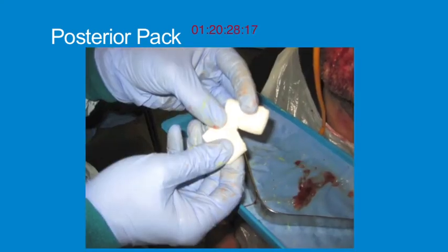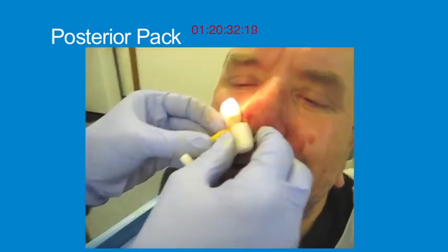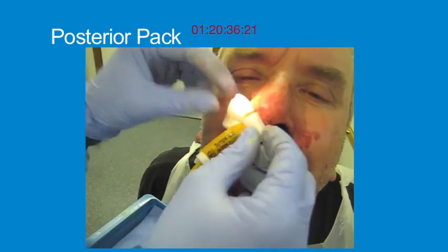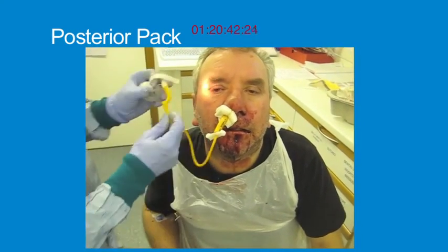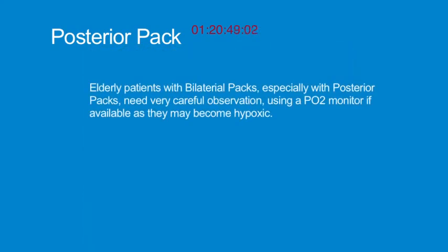In order to correct this, a piece of gauze was inserted to keep the catheter away from the alar skin. The remaining catheter can then be taped to the side of the head or tucked behind the ear. If the patient is very anxious but otherwise healthy, a small dose of diazepam can be given. If the bleeding is profuse and bilateral, then this procedure can be repeated on the other side. Elderly patients with bilateral packs, especially with posterior packs, need very careful observation, using a PO2 monitor if available, as they may become hypoxic.